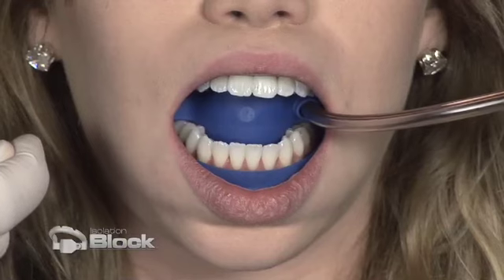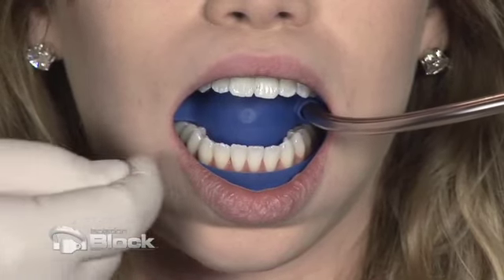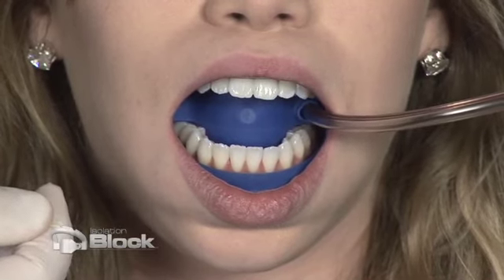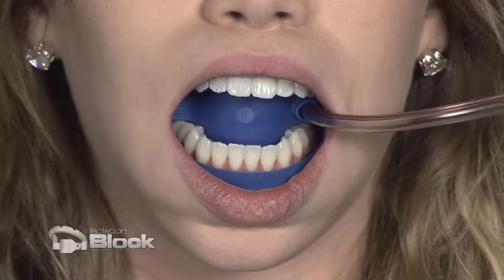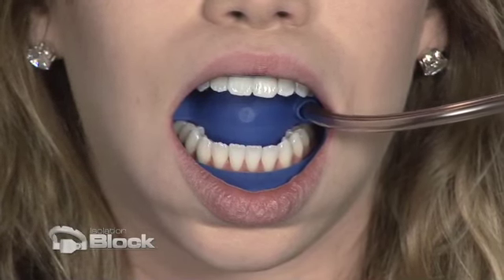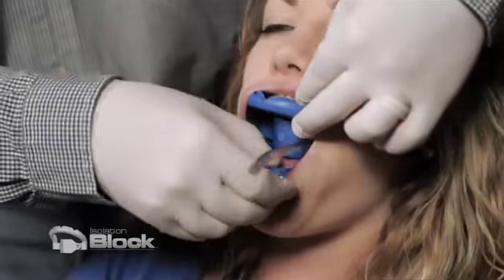Both arches are exposed. In using this for the chairside bleaching, you still have to place the liquid dam material along the gingiva there. But as you can see, for the orthodontics, the teeth are exposed and for bonding the brackets on. Again, in removal, you just have the patient open slightly, and the block slides right out.